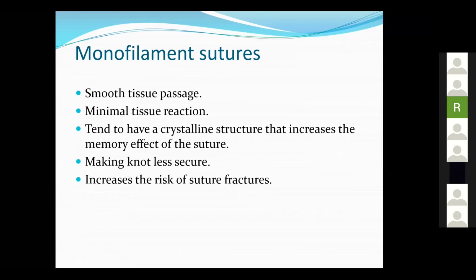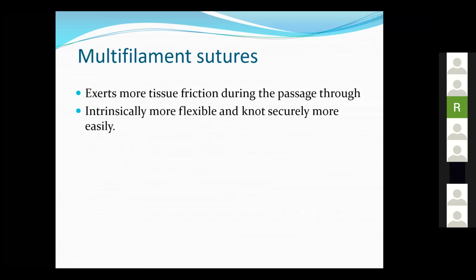If you apply the same artery forceps on vicryl or multifilament, they do not fracture. Monofilament suture materials can fracture. So you have to keep this in mind when handling these tissues, and not apply artery forceps to them. One has to be very careful in dealing with them.